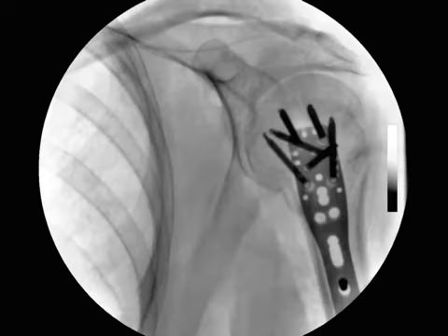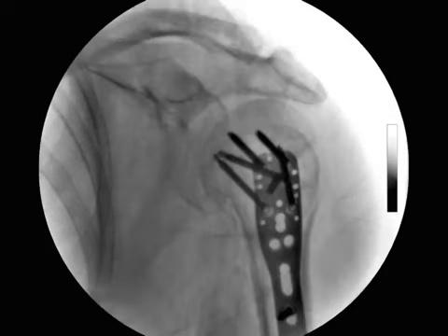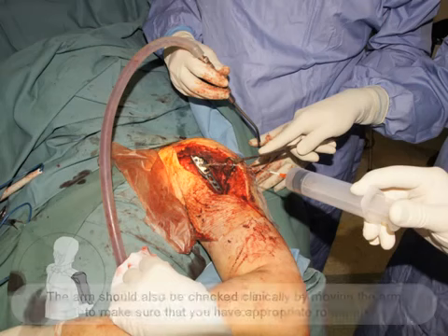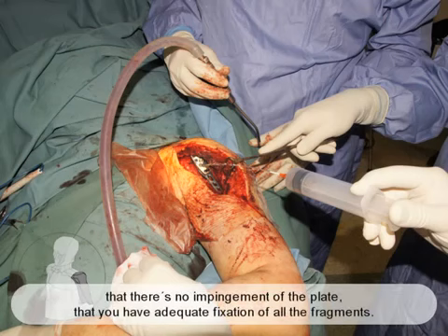And ultimately, final fixation is checked radiographically. The arm should also be checked clinically by moving the arm to make sure that you have appropriate rotation, that there's no impingement of the plate, and you have adequate fixation of all the fragments.